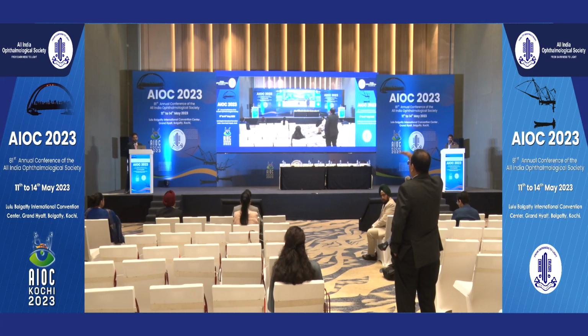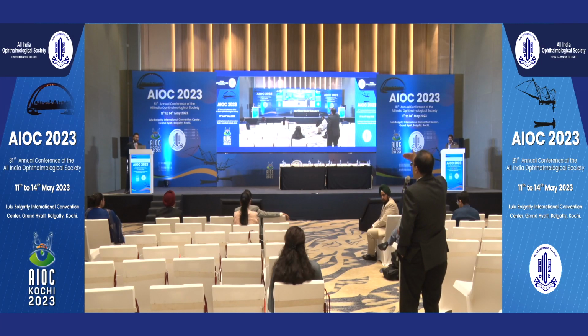And on the OCT, you will be doing serial OCTs. You will be seeing, of course, how the fluid is being resolved, how things are getting better. Fair enough. I think so.